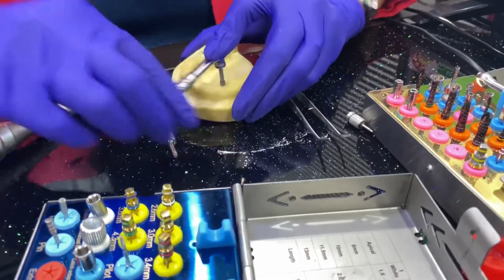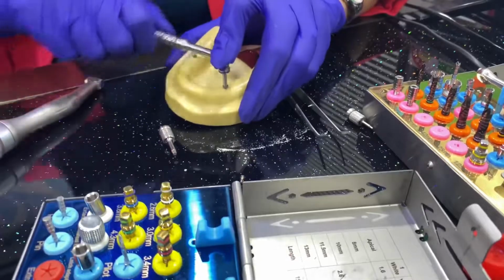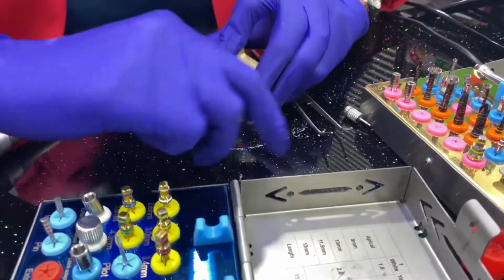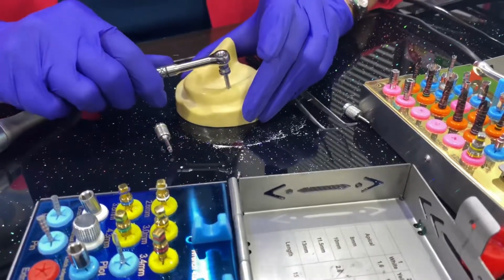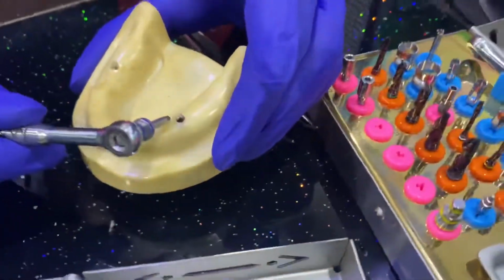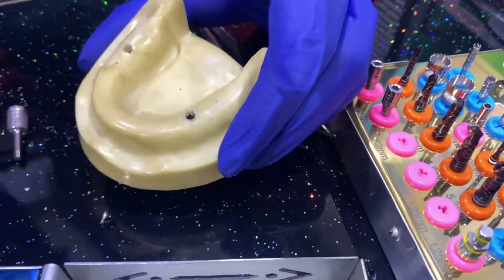As you can see, I haven't used any drilling in this. Just with the help of expanders, the implant is going inside very nicely. You can see, what I like is just 0.2 mm below my bone level.